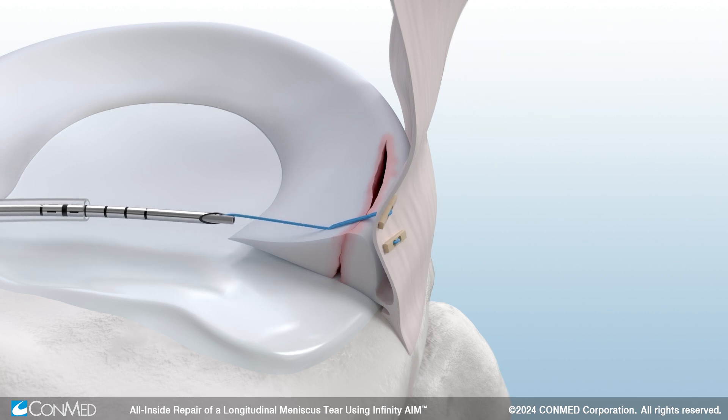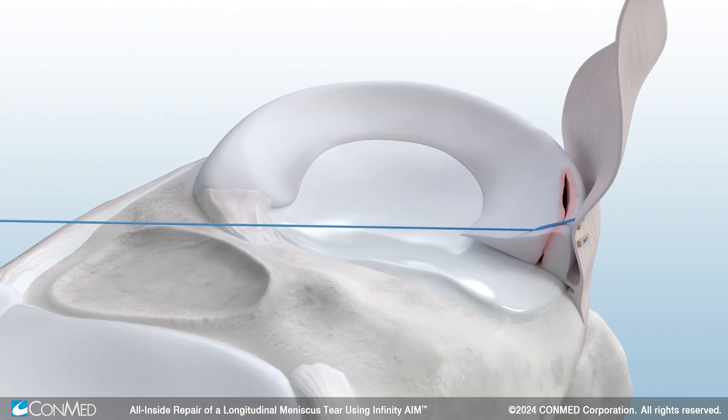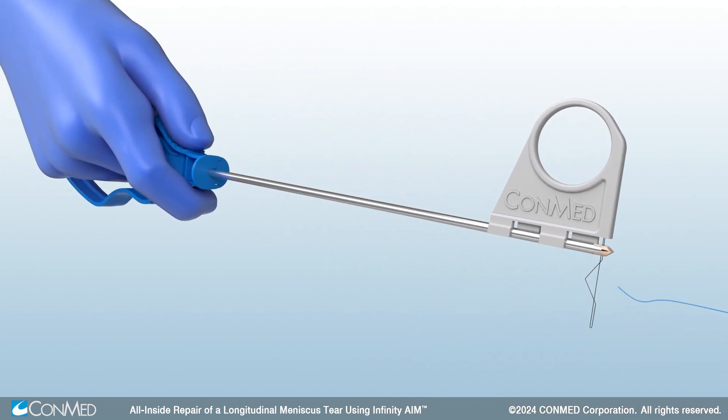An optimal fixation has been achieved. Pull the Infinity Aim meniscal repair device fully out of the knee and working portal. Then use the suture cutter to cut the suture.